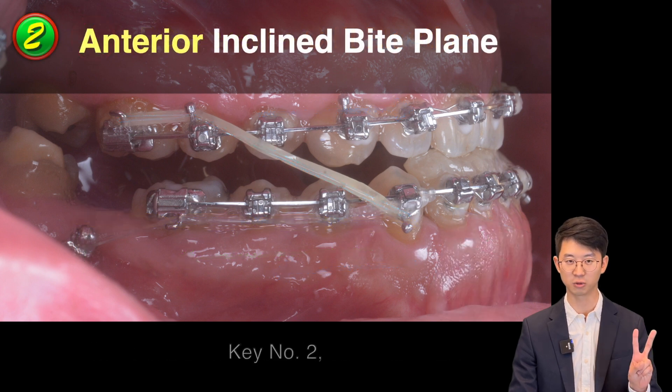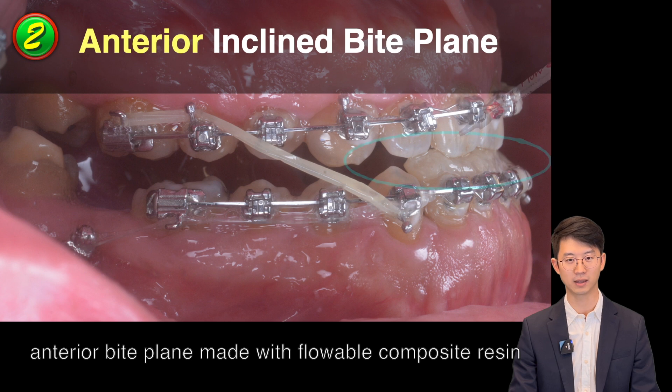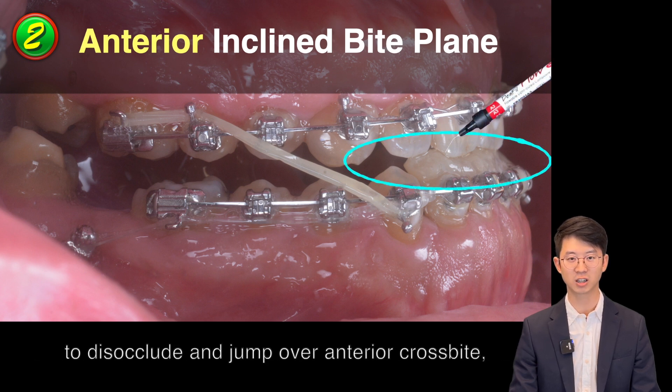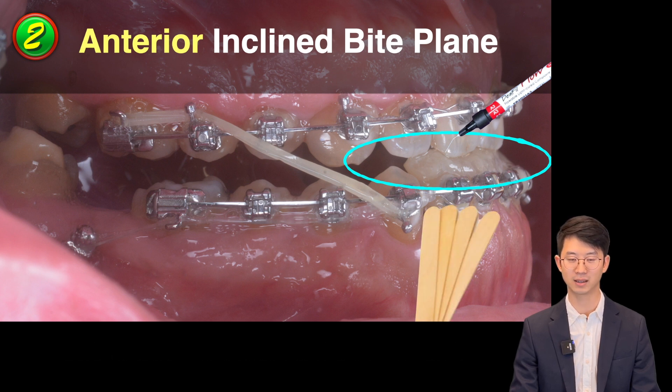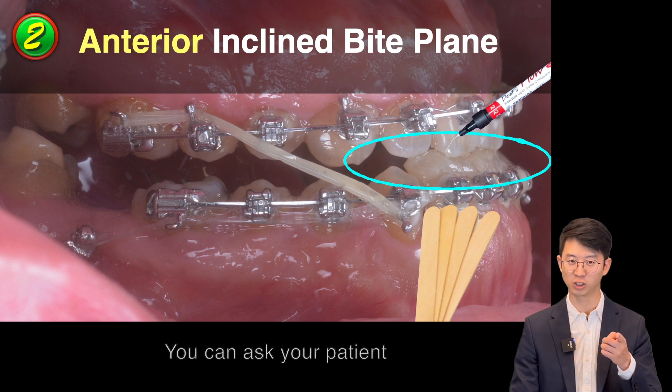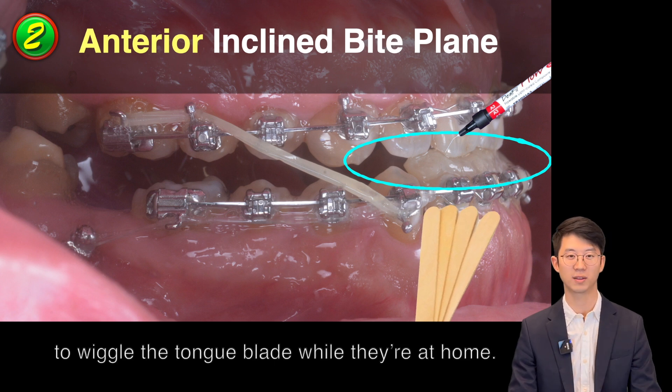Key number 2: Anterior bite plane made from flowable composite resin to disocclude and to jump over anterior crossbite, with the help of elastics and a tongue blade. You can ask your patient to wiggle the tongue blade while they're at home.